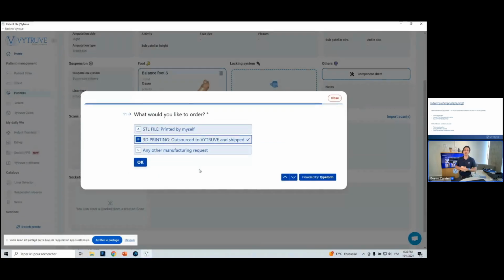And you can also ask Vytruve many other manufacturing requests, because you can ask definitive socket, carbon fiber socket, silicone socket, what you want directly here.